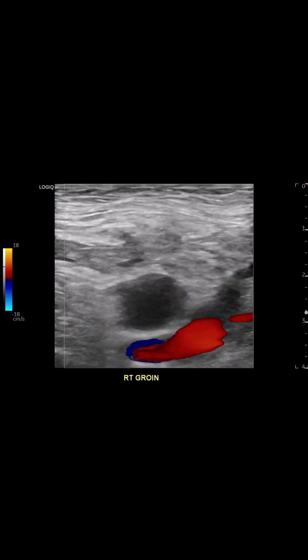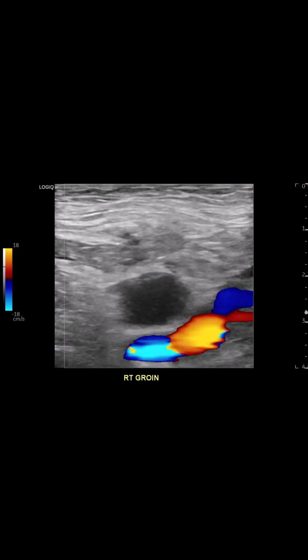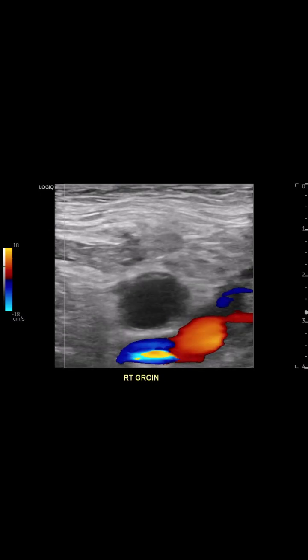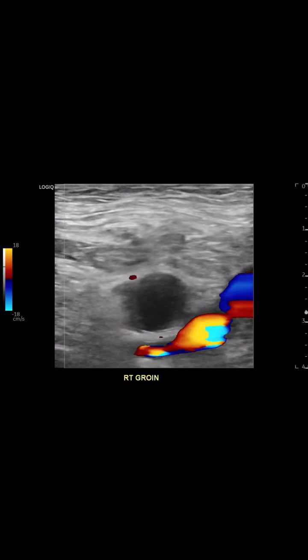Then thrombin is injected. Watch how color flow disappears as the pseudoaneurysm rapidly thromboses, sealing off the chamber.